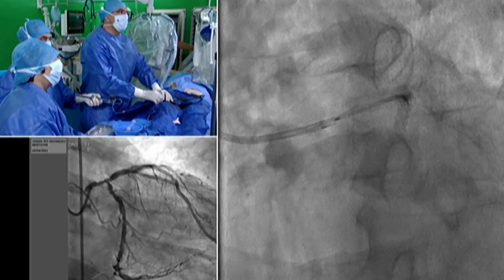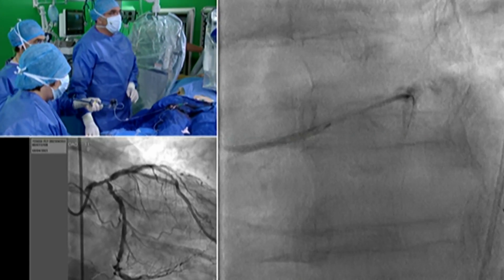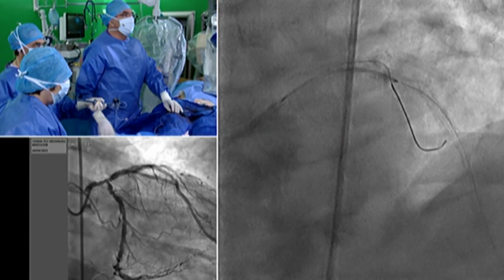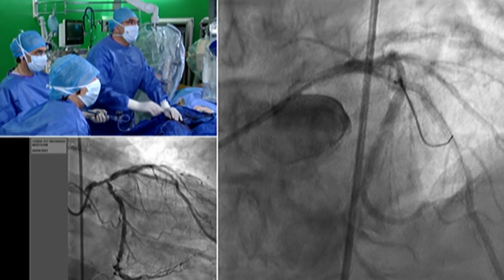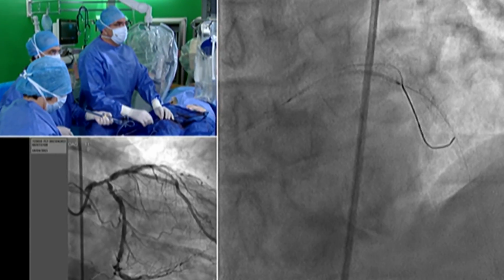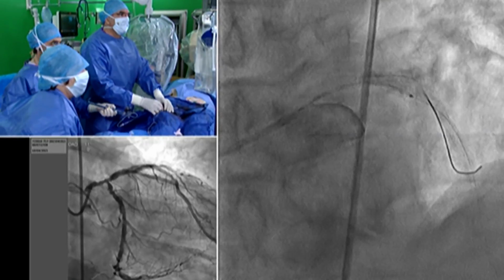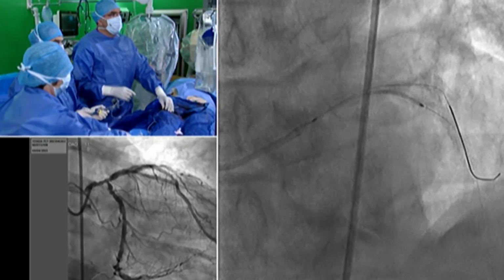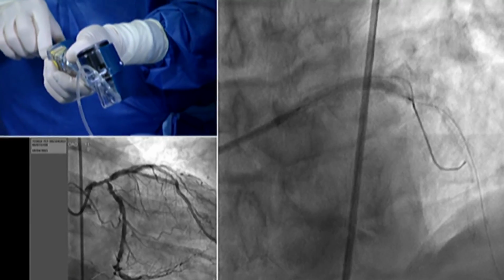Now we are looking to see if the proximal edge of the stent correctly treats and covers the ostium of the left main. So we could take a view here, Veronique. I think it's okay here. It's not too bad. And then we will verify. I think it's correct. Okay, 6. So now we inflate the stent, 6 atmospheres, 8 atmospheres.